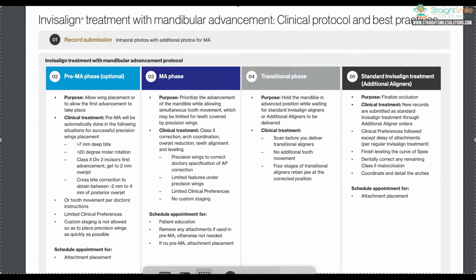Initially when they first came out with their MA, it was only available in the Invisalign First aligners. And personally, I think those are overpriced at, I don't know, what are they, $1,100 or something like that. You get 18 months to finish it. It's only for fixing bites and aligning 2 to 2 basically in front. It's an alternative to a 2x4, but you can do phase 1 aligners with ClearCorrect if you want to. They'll do it. I've done it. You can do it with white label.